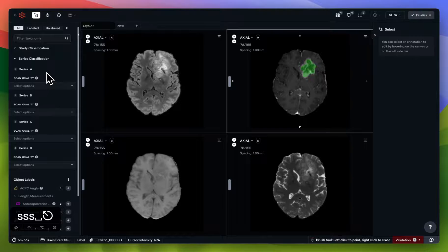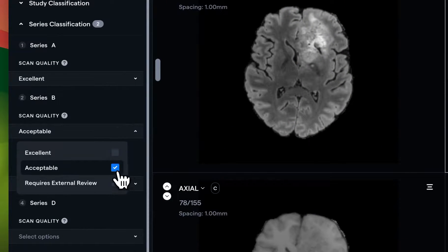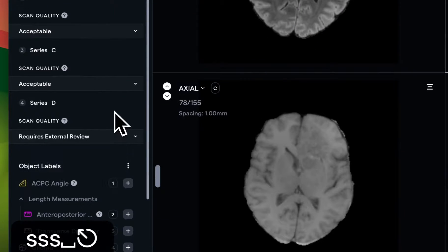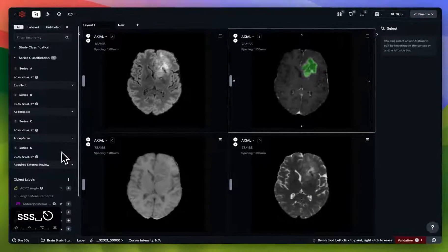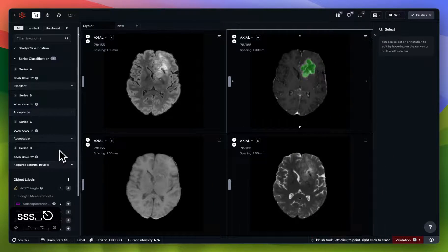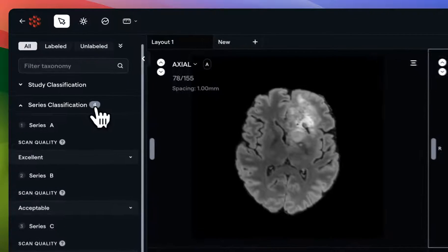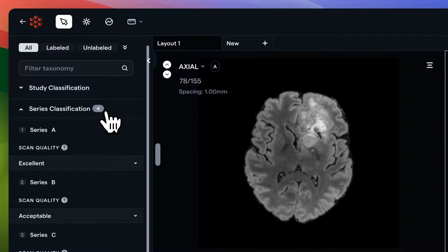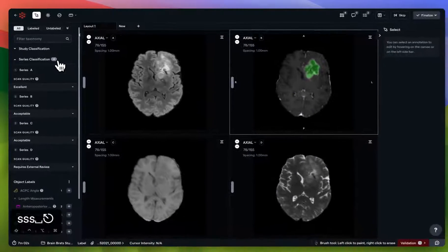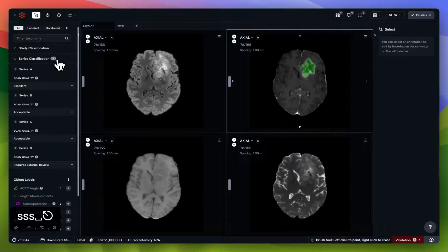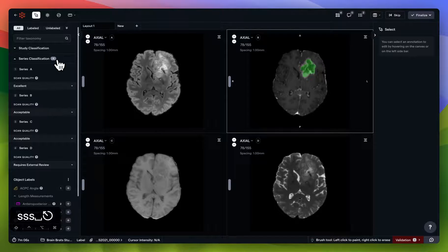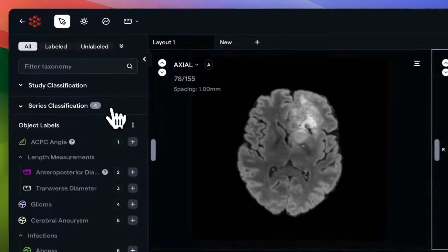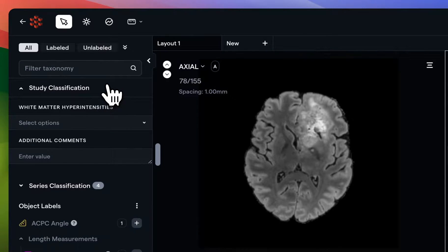Now that I've ascribed a scan quality attribute to each of these scans, you'll see that four data points have been generated here. There's no limit to the number of series classifications that you can create, and all of them have to be either booleans, text fields, single selects, or multi-selects.